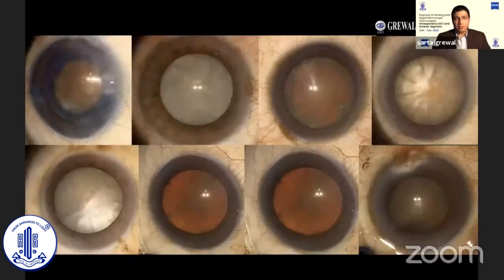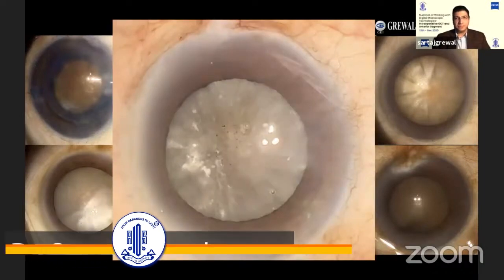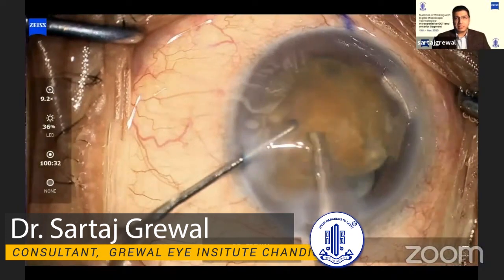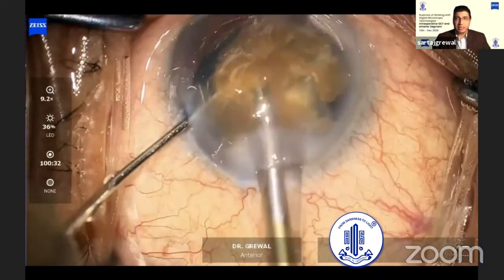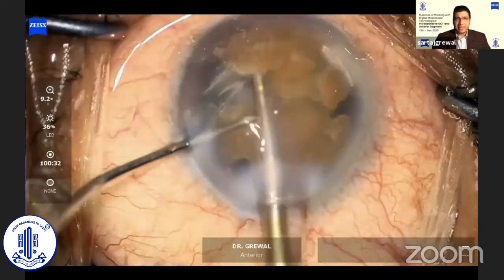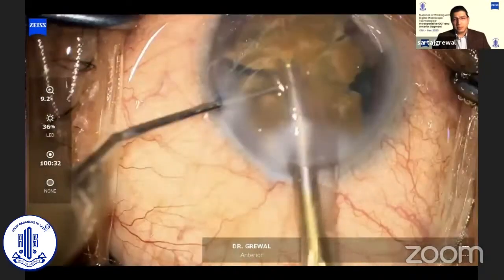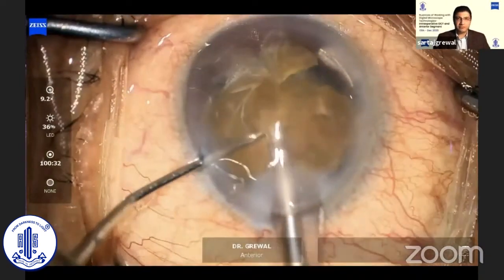We all come across scenarios like these in our clinical practice. Terrifying cataracts such as these can give us sleepless nights before the surgery. Dense cataracts can be a struggle right from the initial chop and through every step of nuclear disassembly, especially when they have a dense, leathery posterior plate that just refuses to come apart. It poses a challenge in further division of the nucleus and in emulsifying those pieces.